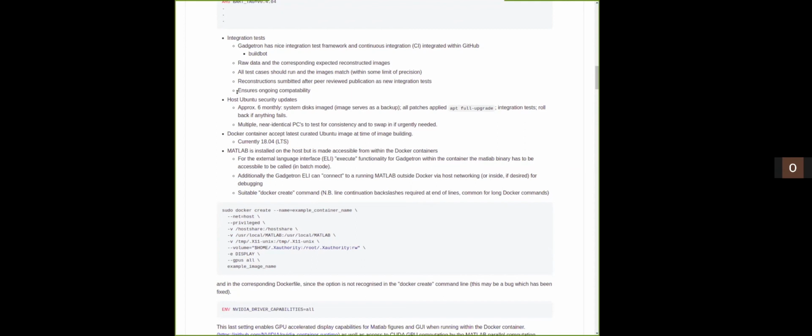And obviously the point here is that this is good for everyone. It ensures that bugs haven't been introduced in the underlying things. It ensures that our code is still running when someone else changes some other part of the system.